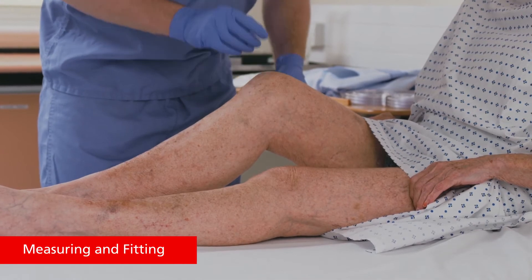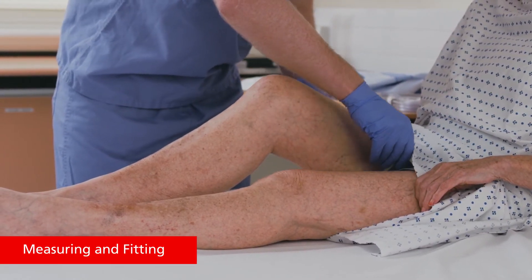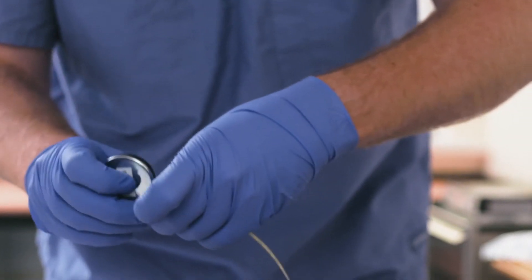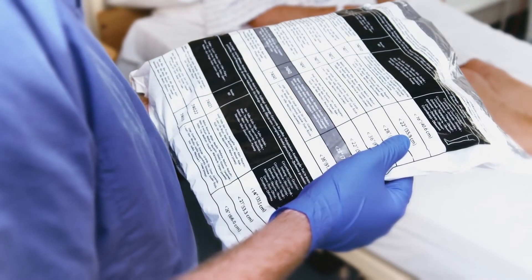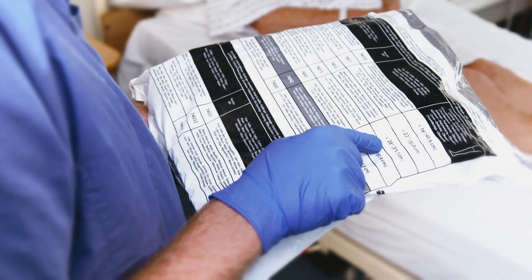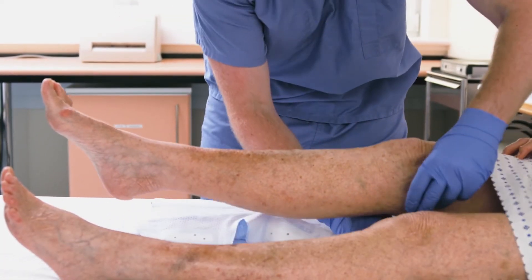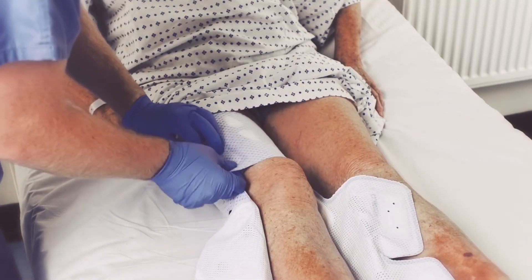Before applying a sleeve, it's important to measure the patient to identify the appropriately sized sleeve. For thigh length sleeves, measure the circumference of the patient's thigh at the widest part, then refer to the Kendall SCD system sizing chart to determine the correct sleeve size. To place the thigh length sleeve, first orientate it with the back of the patient's leg, then wrap the sleeve around the leg, fastening the Velcro closure tabs.